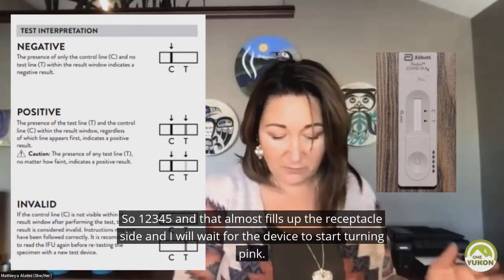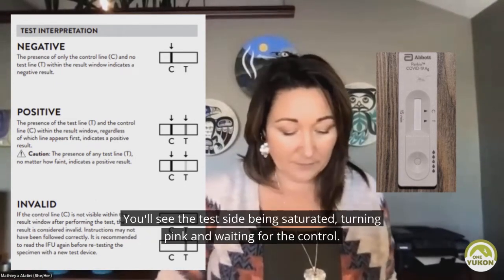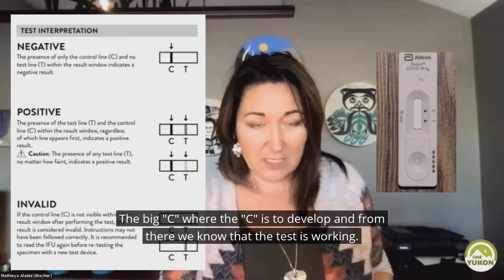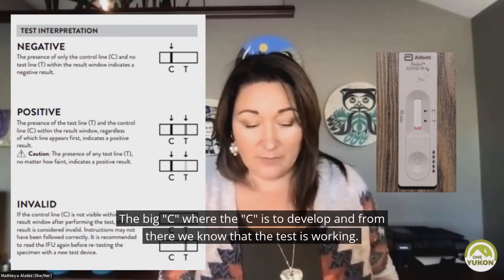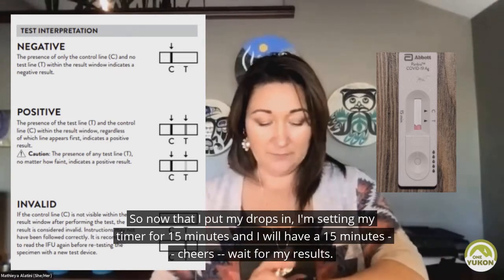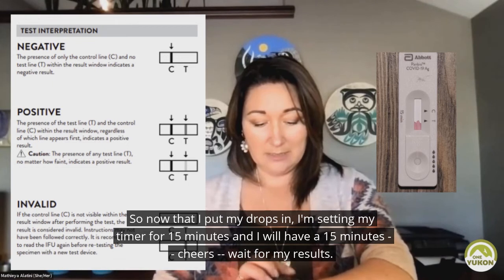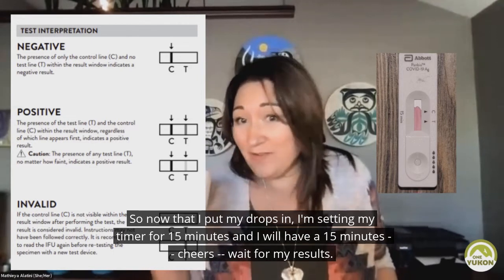I will wait for the device to start turning pink. You'll see the test side being saturated, turning pink, and waiting for the control — the big C, where the C is — to develop. And from there, we know that the test is working. Now that I've put my drops in, I'm setting my timer for 15 minutes. I will wait 15 minutes for my results.